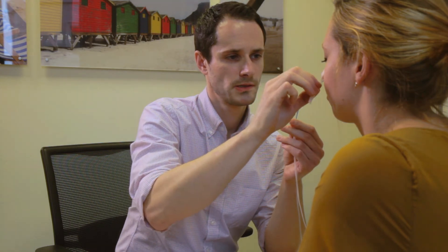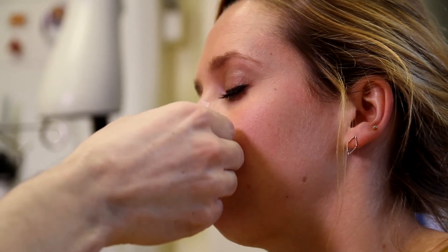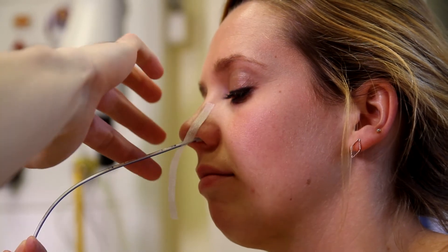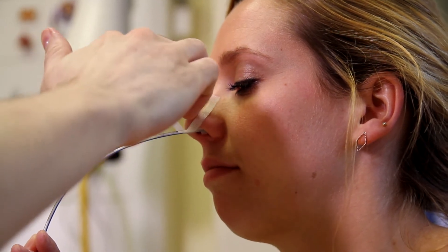When I've found the most negative point in the nostril, I fix it and record the distance. That's at four centimeters in your nose. In about 30 seconds it'll start running from the tip and drip.